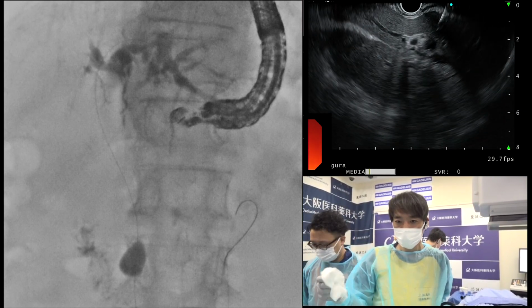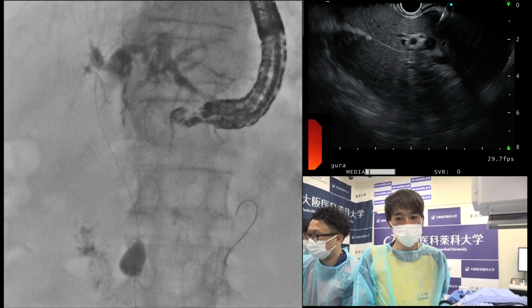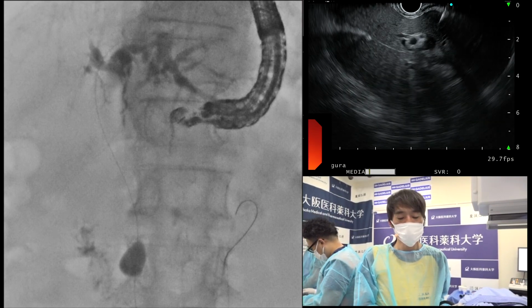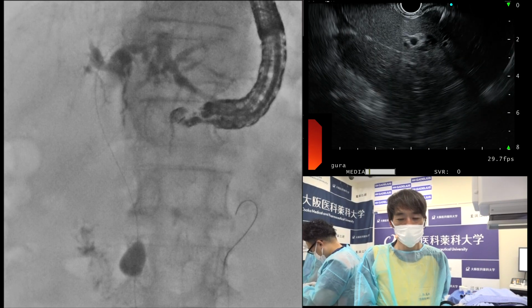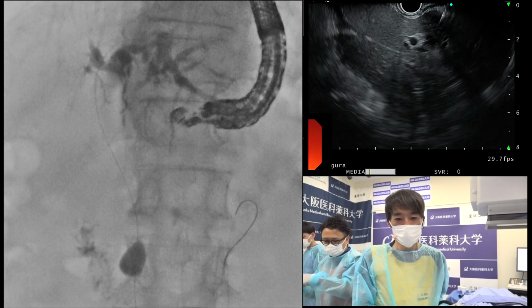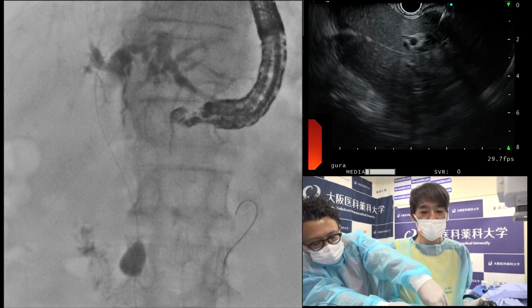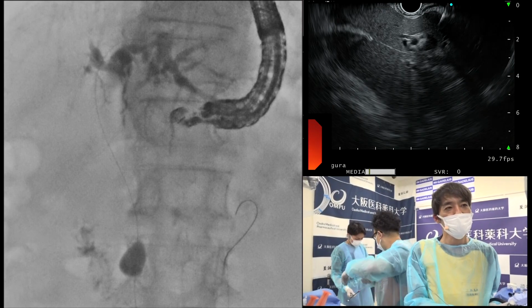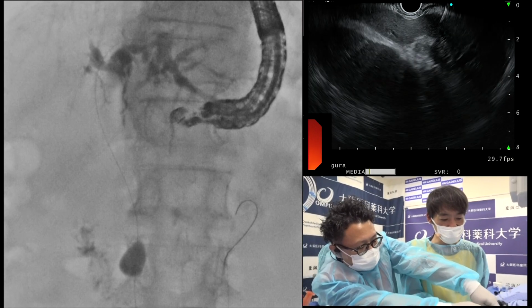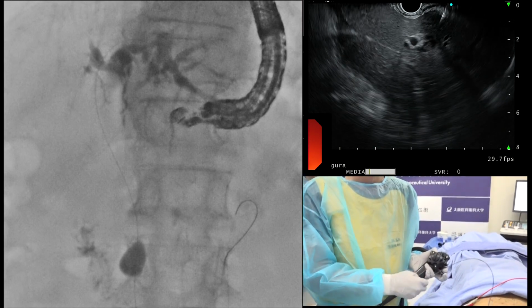I think you made a very important point regarding the risk of cholangitis if you decide to place a choledochoduodenostomy in the presence of a gastric outlet obstruction. So can you just take us through the reasoning there? Is the level of the obstruction important? If it's a type 1, type 2 or type 3 duodenal obstruction, does that influence your decision making in any way? Yeah. So if type 2 biliary duodenal obstruction, it may influence stent patency for choledochoduodenostomy.